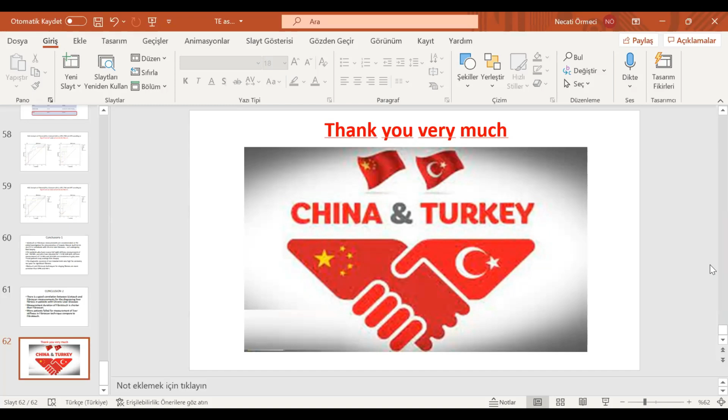Actually, I have experience using both FibroScan and FibroTouch, and we do not have the XL probe with us. With FibroTouch, the beauty is that even in obese patients, we can get a good estimate of liver elasticity. So if we see obese patients, we use FibroTouch to measure the elasticity. Thank you.